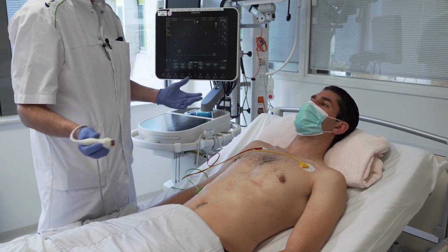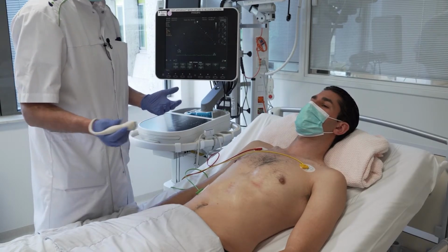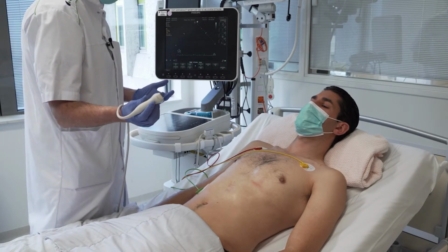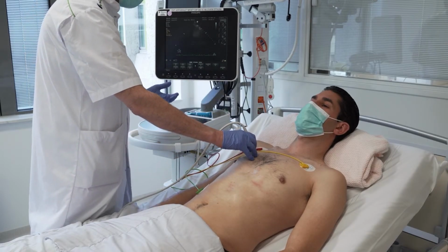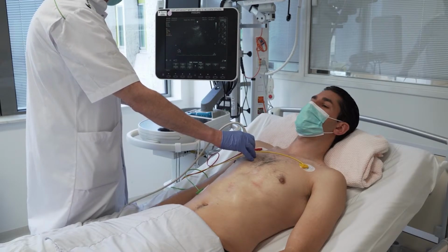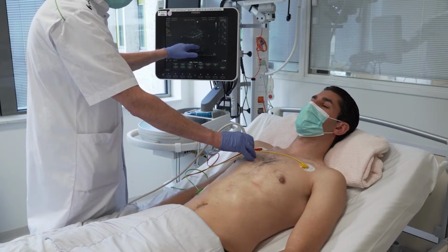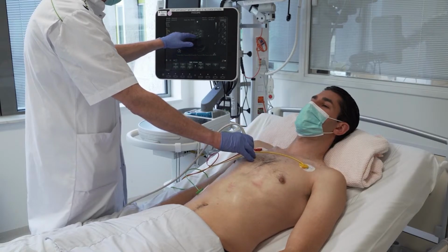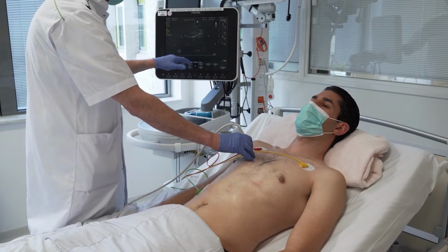Again, in practice, this will be very fast. You can do the views very fast after each other. But for learning purposes, we will go a bit slower. So again, in the acute setting, we continue with the thoracic views. That's about here. You need to really zoom in to see the pleural sliding. Maybe you can take a deep breath, please. And you see very nice pleural sliding here. So patient has no pneumothorax.